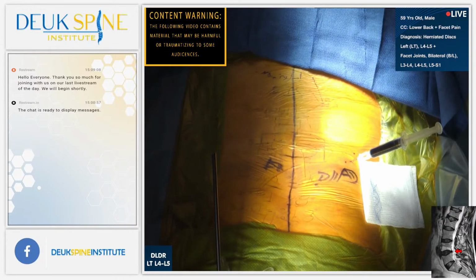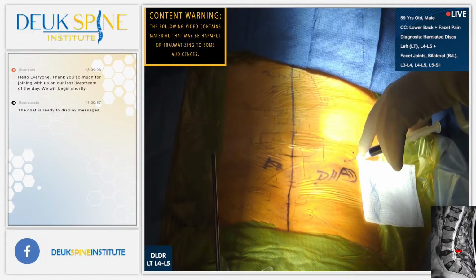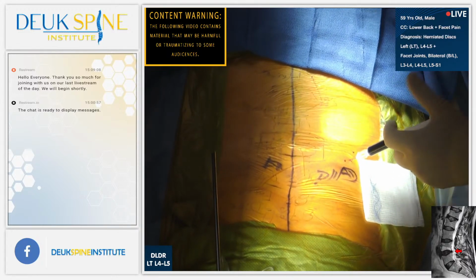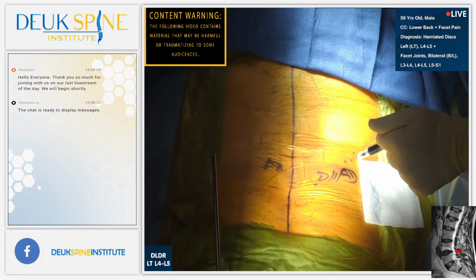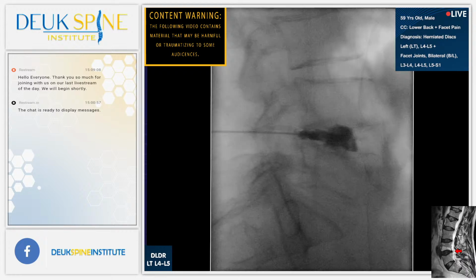Okay, is he ready? My friend, can you open your eyes? Are you comfy? Are you comfortable? He said yes. Any pain right now? How bad is that on a scale of 1 to 10? How high does it go? 8. Is that where you get your back pain, typically? All right, we got 8 out of 10, concordant. When you wake up, that pain will be gone along with your facet pain. Count from 1 to 100 out loud so I can hear you.